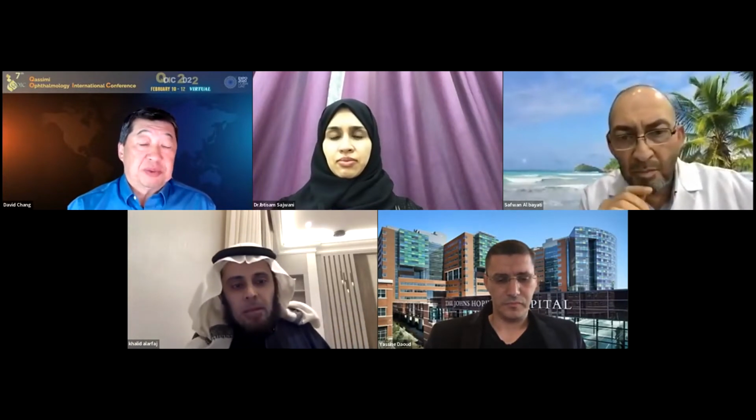Sure. Well, most of the time, the enhancement with the toric is changing the axis. So number 1 reason is post-op rotation. Number 2 is that you put it where you thought it should be, but your post-op analysis says, well, 10 degrees or 15 degrees different would give you a better result. And it's, in my mind, very easy to do. It's very safe. We do it in the operating room. And I think all of us should be pretty aggressive about rotating the lens because that's your best enhancement.